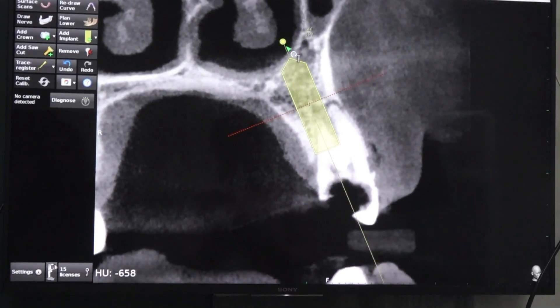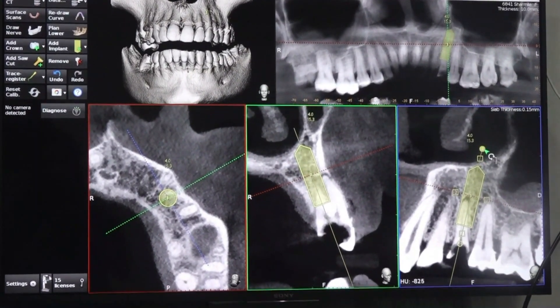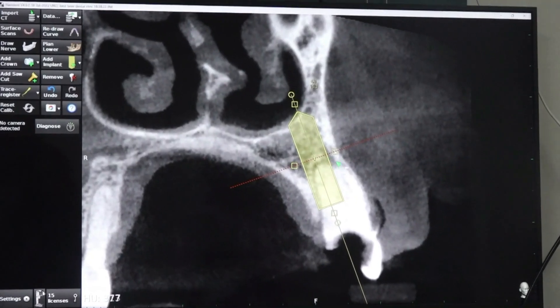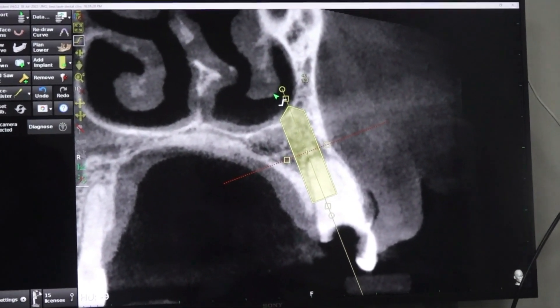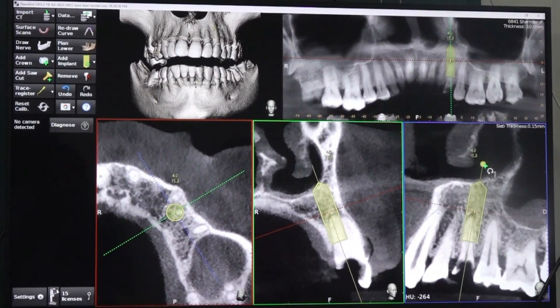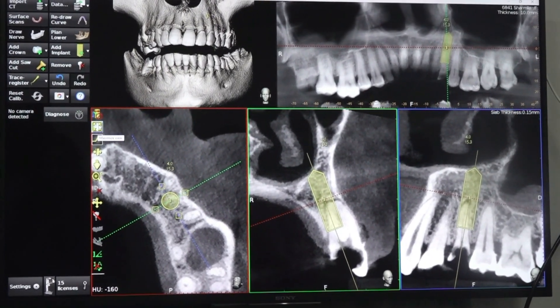So 4.2 into 16 will be a correct plan. If you tilt more palatally the length will reduce. If you tilt slightly buccally you will get good length. Tilting mesially doesn't help much after the fused bucco-lingual segment. So better to place the axial implant straight — don't do any tilting.